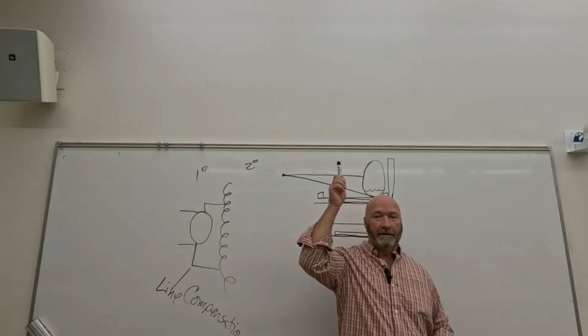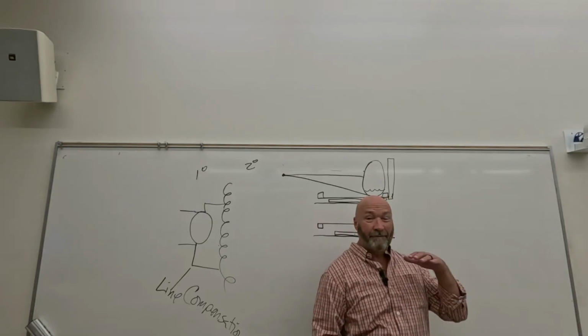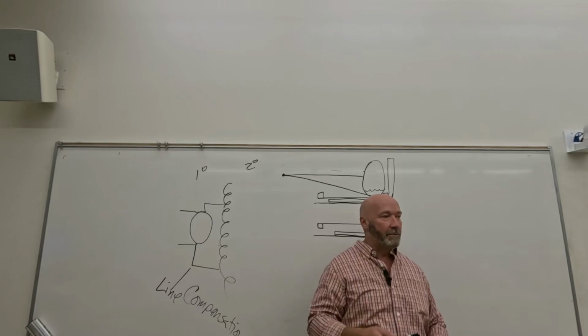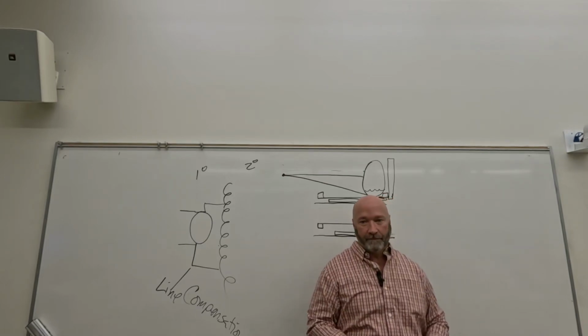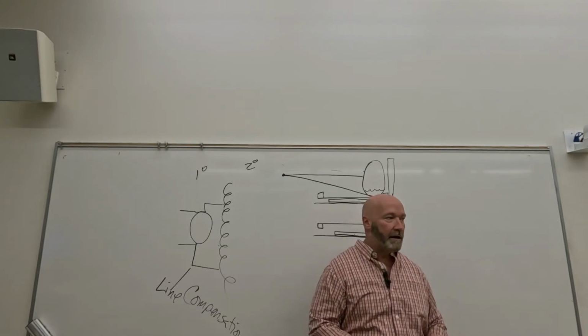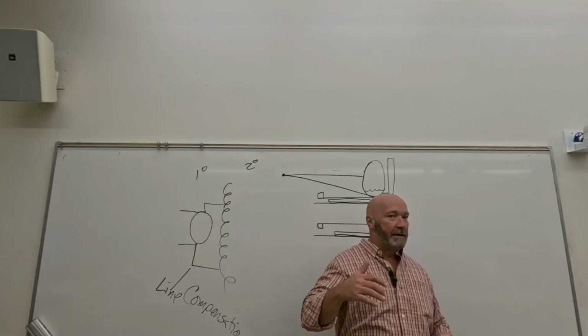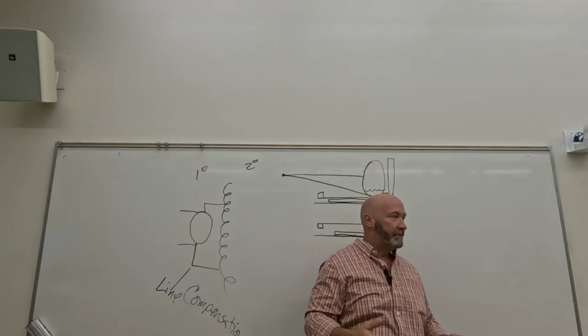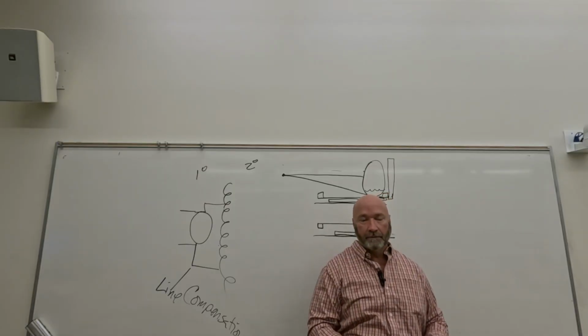There may not be any shielding in the ceiling and floor, because if you have like a foot of concrete, you don't really have to worry about it. And our external wall, I don't know if it has any shielding in it or not. If the X-ray room is above a certain height, then you don't have to have any shielding on the external wall, okay?